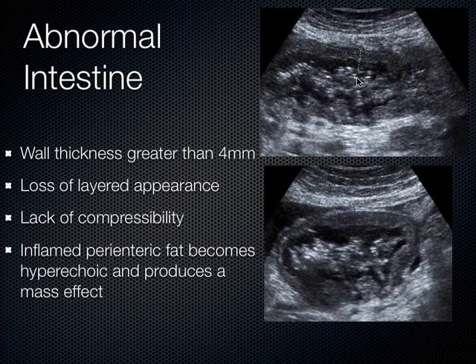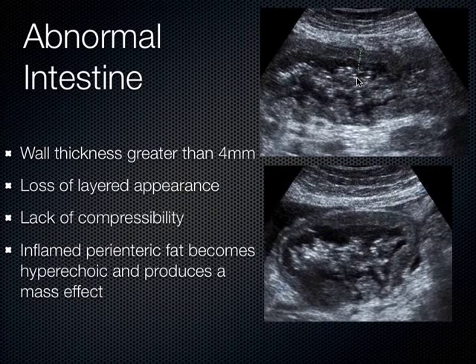In normal individuals, when you compress the bowel, they're all slipping and sliding — it's called the sliding organ sign. They slide amongst one another in the peritoneal cavity. When you have abnormal intestine, you lose that sliding, that layered appearance, and you lose the compressibility. Abnormal bowel — specifically when talking about appendicitis — is a non-compressible tubular structure. Sometimes you get perienteric fat around the rim of the intestine when there's inflammation going on.